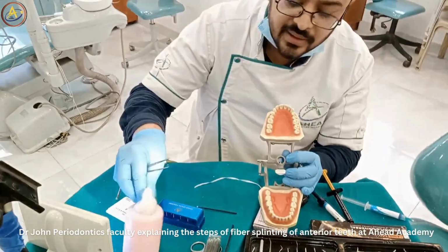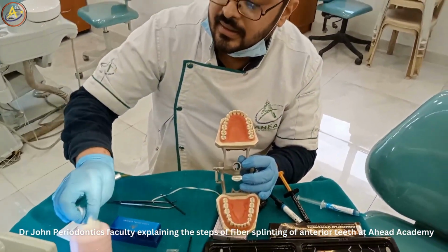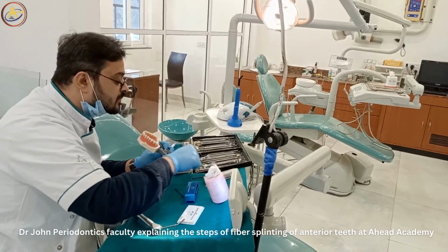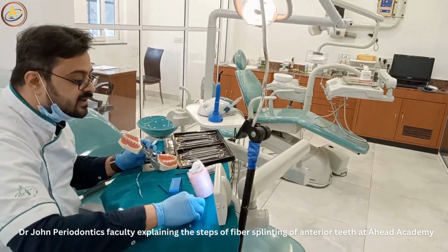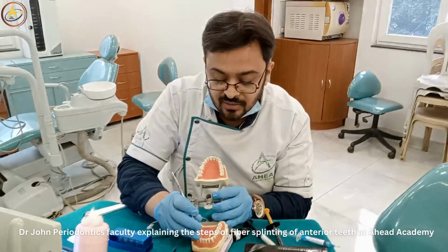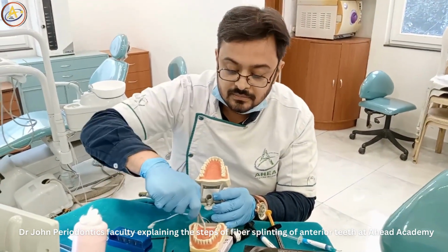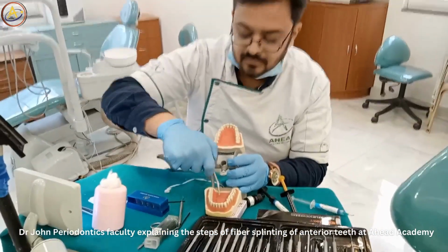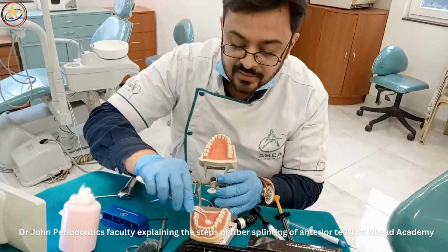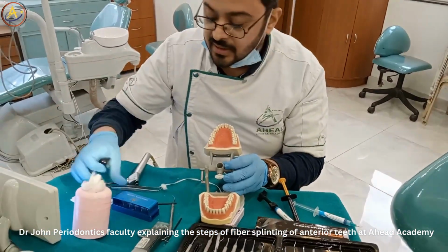we'll take some cotton. This is a typodont, so we can have some cotton also in case of the water. Okay. Then you inspect how the etchant is removed from all the sides. If you think there is some liquid elsewhere, again try to dry it. Okay. Now it is dried. Now what is the second work? That is the bonding agent.